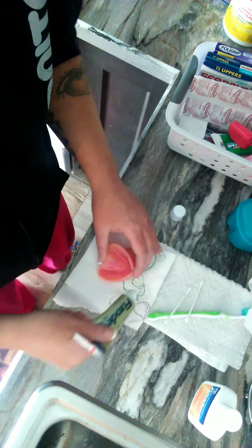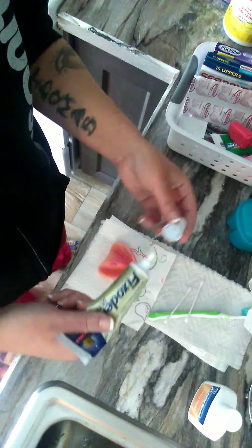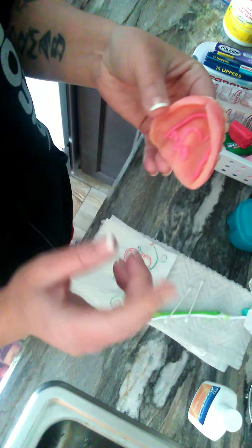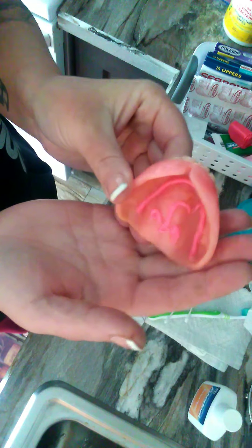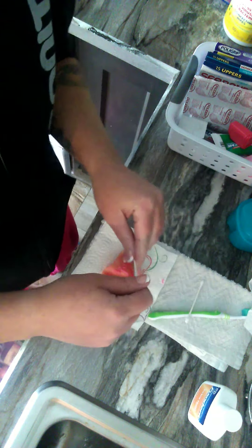I spread it around. Because now, guys, if you use adhesive — especially this kind of adhesive that's thicker — you want to spread it around. The reason why I'm showing you is because if one side has more in it, it's going to be lopsided when you put it in. You don't want lopsided. Lopsided sucks.